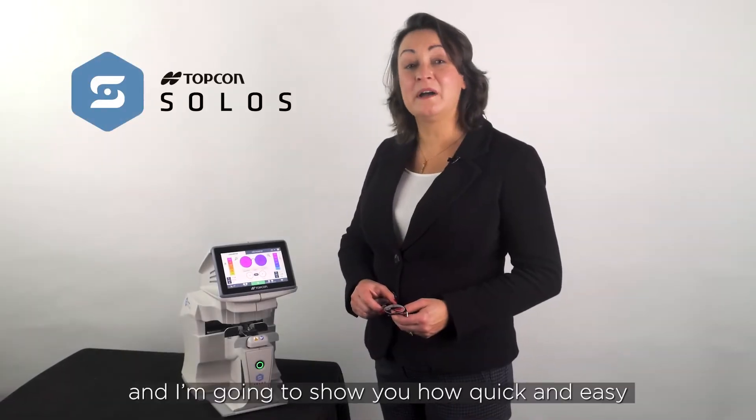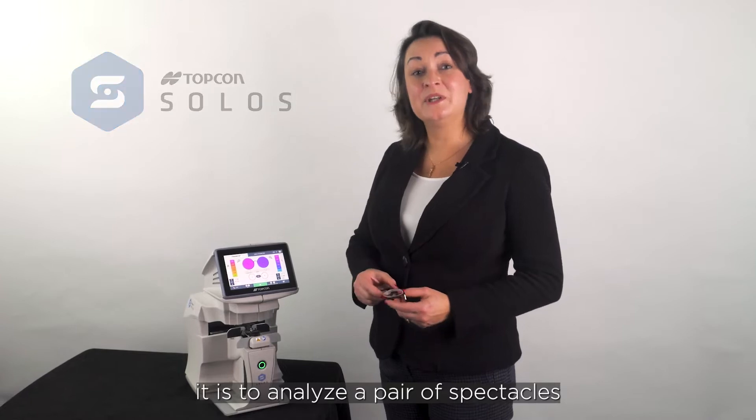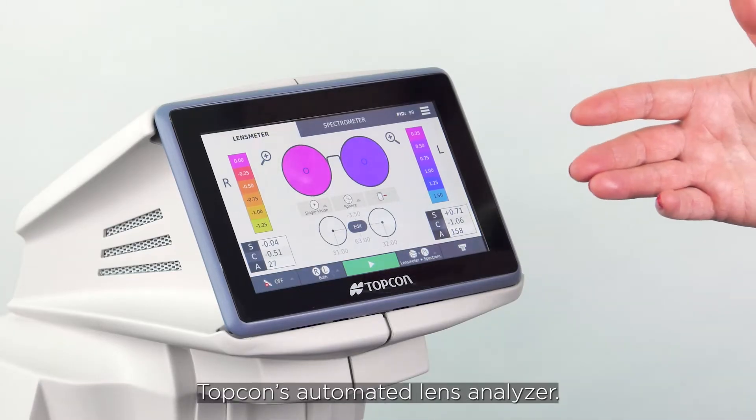Hello, I'm Catherine and I'm going to show you how quick and easy it is to analyze a pair of spectacles using the Solos, Topcon's automated lens analyzer.